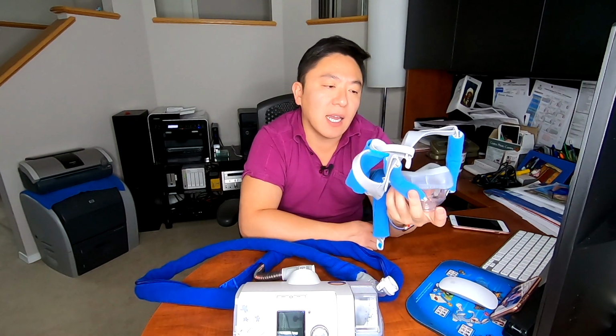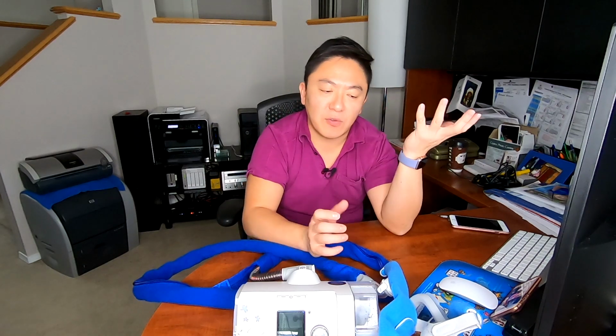It does take a little while to get used to because you've got this funky alien thing strapped to your face at night, and of course I have a tendency to sleep on my back and then somewhat on my side. And if you've never used a face mask before, people will either take it off in the middle of the night or they knock it loose and then you get a whole bunch of air leaks, and it's just not a very pleasant experience.